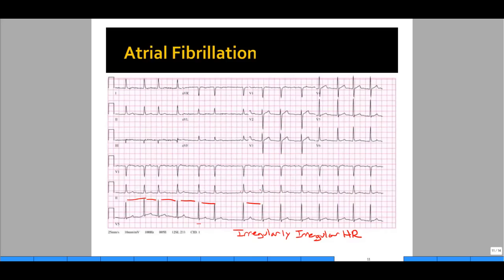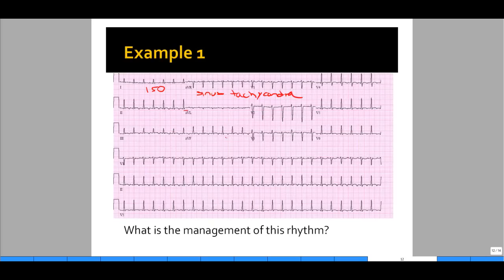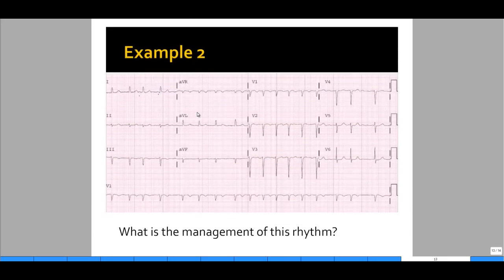Let's take a look at our first example — you can pause here to identify it yourself. We see P waves before every QRS and narrow complex QRSs, so we know this is sinus. Looking at the heart rate, the rate is pretty fast — almost about two boxes between each R, making about a heart rate of 150. So this looks like sinus tachycardia. What's important to note is the management: if someone has sinus tachycardia, you do not treat just the plain old sinus tachycardia itself.